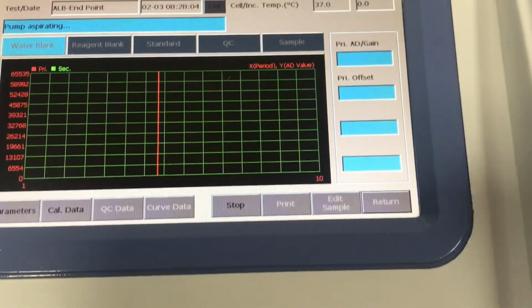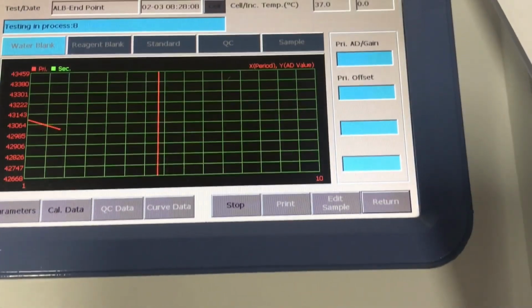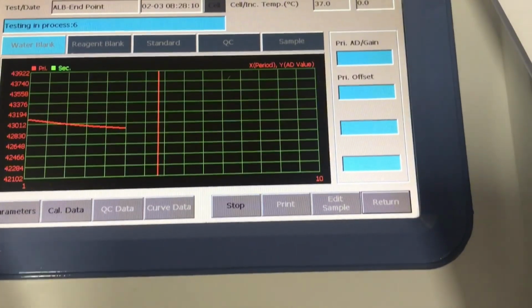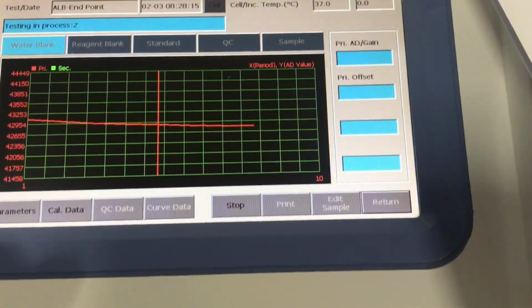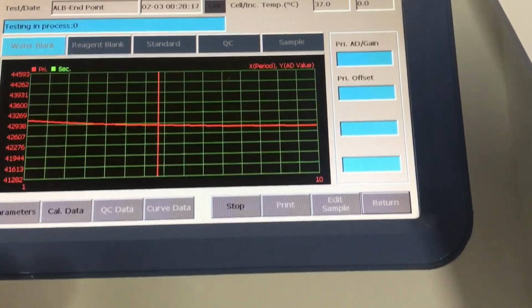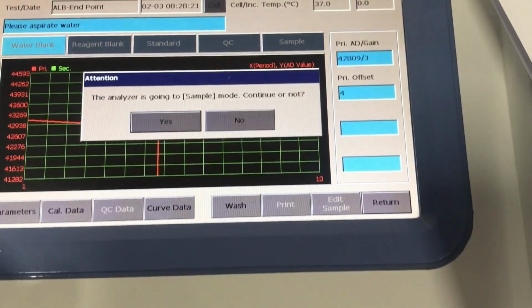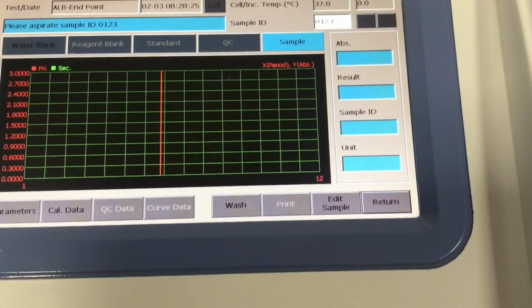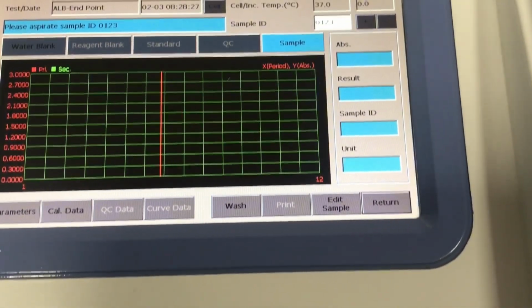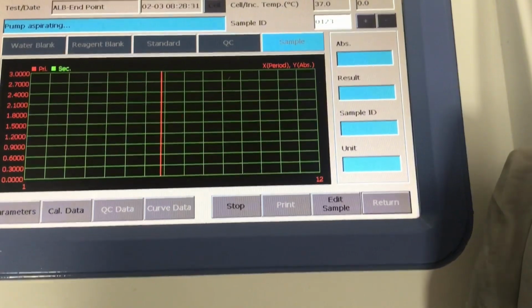So these are all things that you should be mindful of. Trends, shifts, and we're going to talk about all of them as we go on. And these are things that are very technical, and the more you go on, the more you gain experience, the more you're able to work out and produce quality and reproducible results with your machine. So we're going to measure our fifth one.